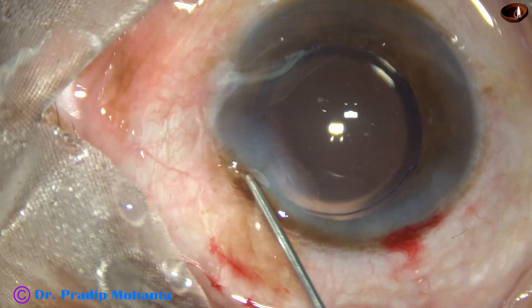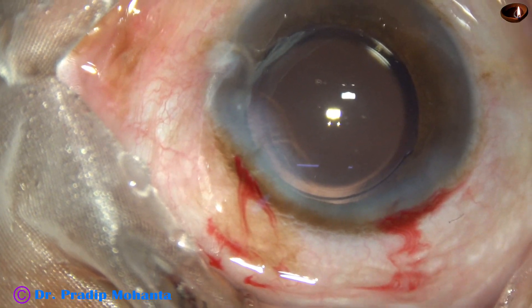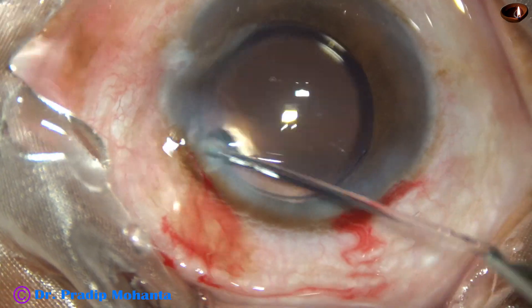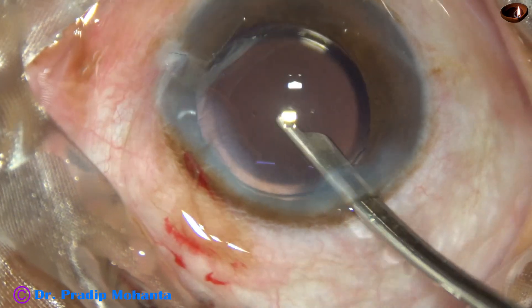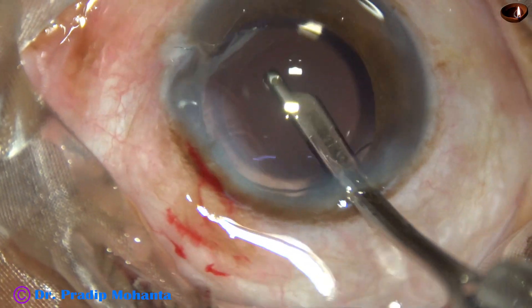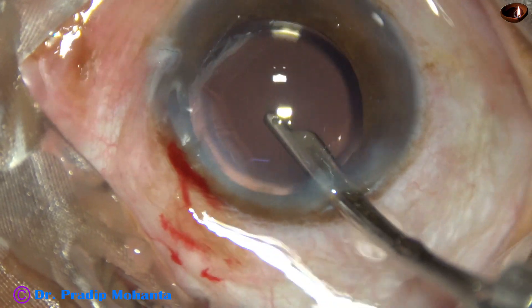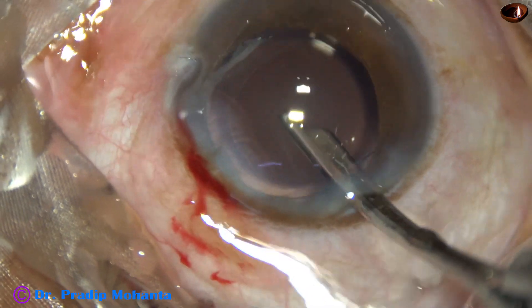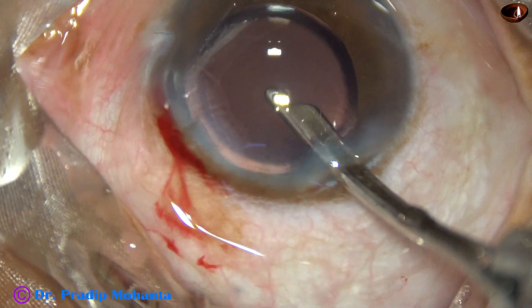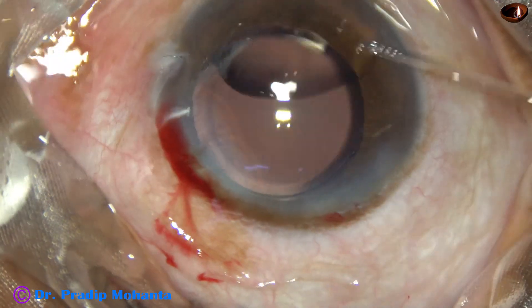A final lavage of the anterior chamber is done with BSS balanced salt solution. After the final lavage, the anterior chamber is formed nicely and the case is concluded.